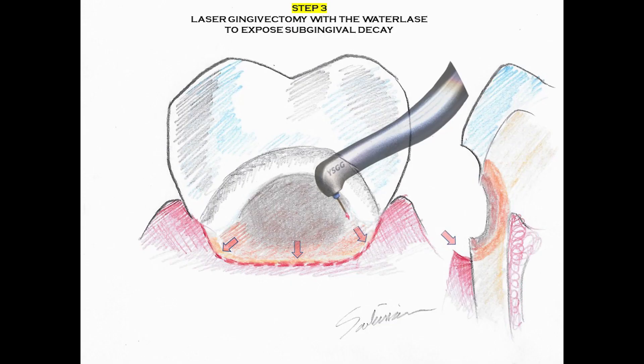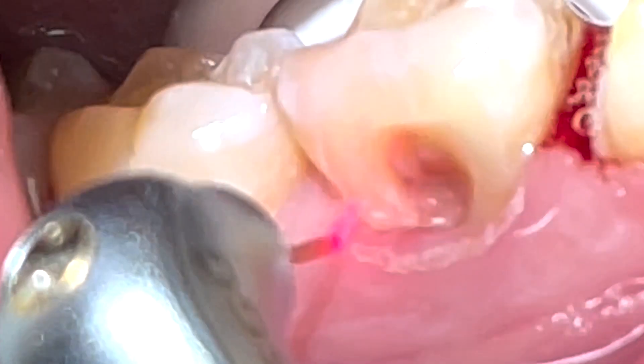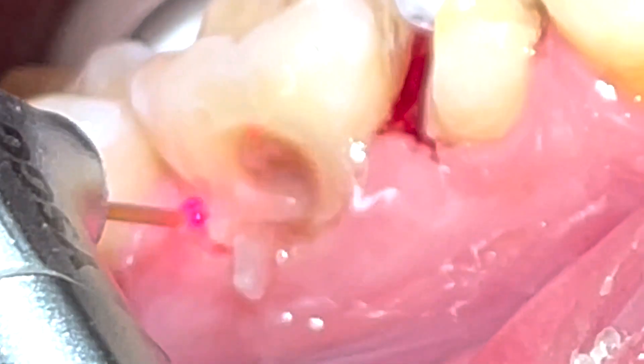The next step, which is one of the most important steps, is to use the Waterlase in order to remove and trim back the gums that are covering the decayed tooth structure along the neck of the tooth, or the cervical margin.